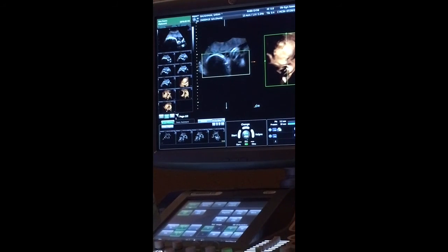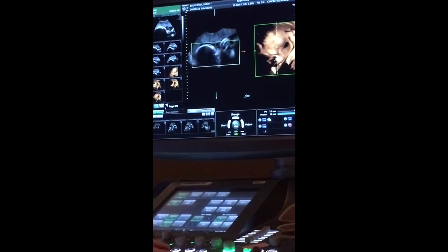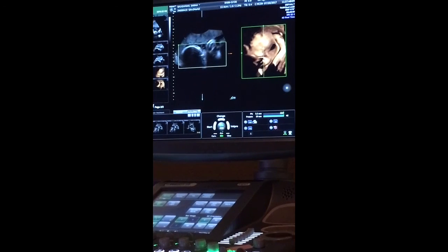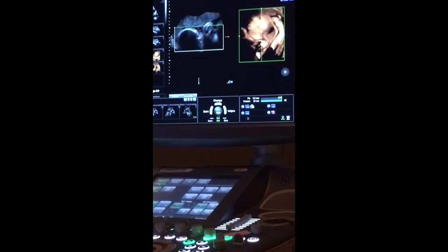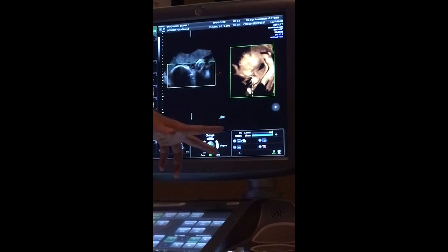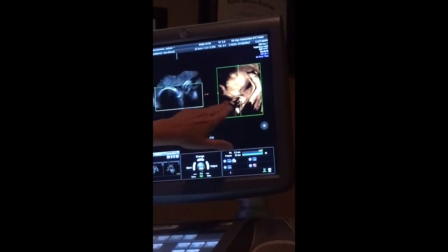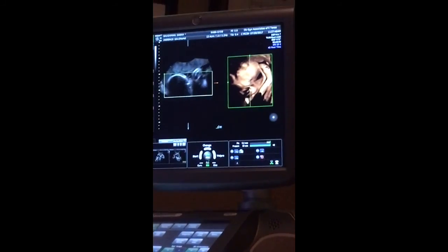It looks like the skin's open. So you're actually looking into the arm, because my focal zone is right through the middle of it. If I move it out, then we're into the placenta. If I move it in, there's kind of a fine line, because the babies don't lay completely neutral. Like this sticks out on you more than this and this. It would work the same way if I were doing a full scan on your body. So there's parts of it you can see better. I can see that elbow if I come out and manipulate my image a little bit, but I lose my face view. So that's why it looks kind of weird right there. I'm trying to get the face view and a foot, but you can't see all of that arm and elbow.